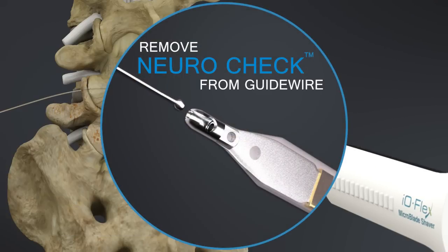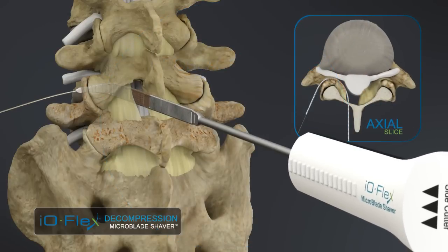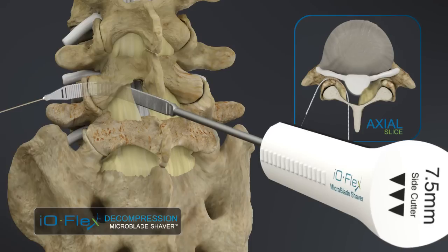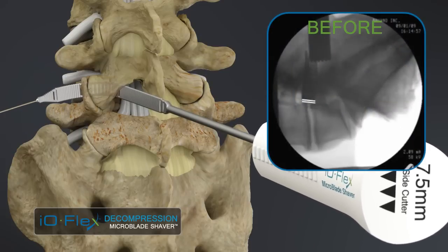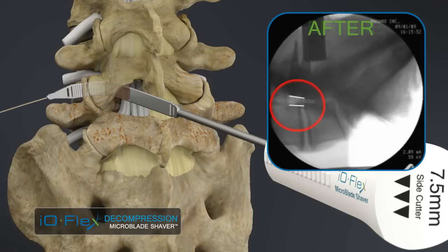Following confirmation, the neurocheck device is removed and the microblade shaver device is pulled across the target tissue and into the foramen. Reciprocations of the bimanually controlled system result in direct removal of impinging ligament and bone. Assessment of the decompression is accomplished by comparing subsequent lateral fluoroscopy images.